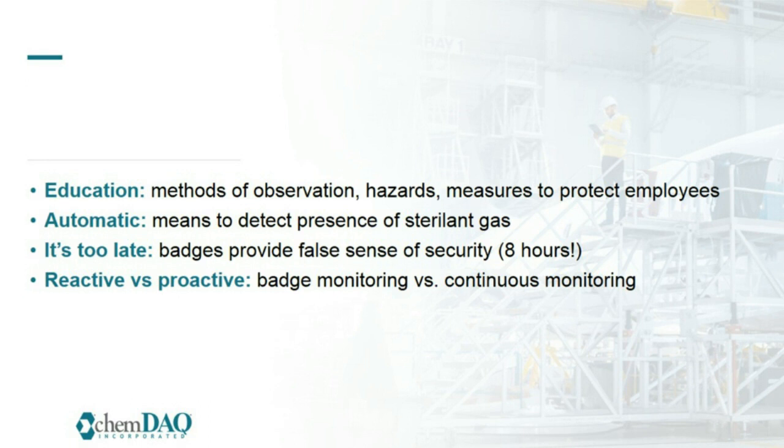We would have sent the badges off, and we would have got the report back that they were exposed to very high levels, but we didn't know when. And we didn't know how many people, from the time of the exposure until the time the badges came back, had continued to be exposed. So this is a real significant issue.